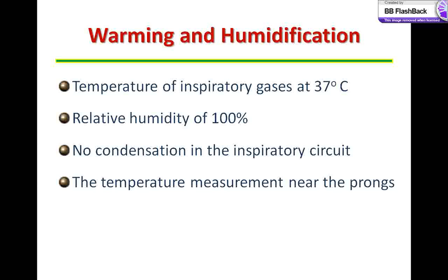We have realized that warming and humidification are as essential as providing oxygen and pressure for a baby on CPAP. The crux is to maintain a relative humidity of 100% and a temperature of gases of 37 degrees while the gas enters a patient's interface.